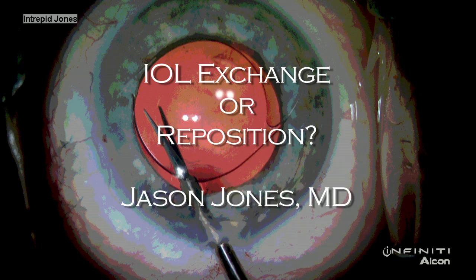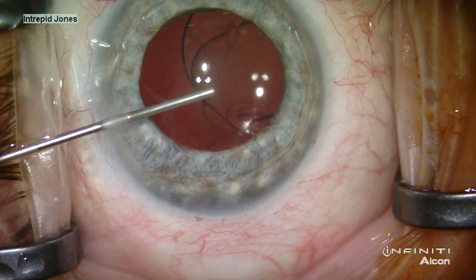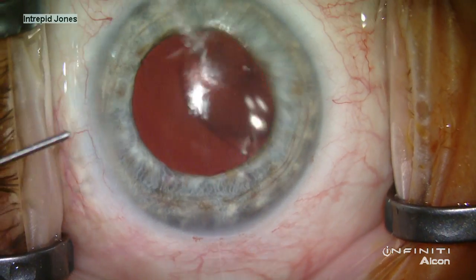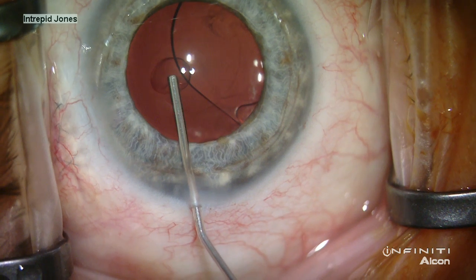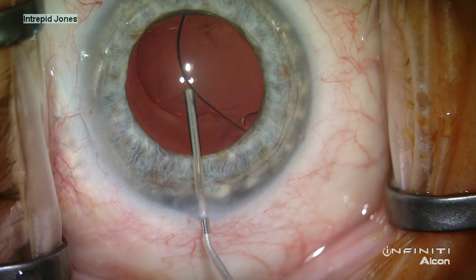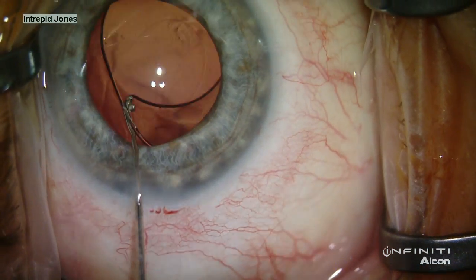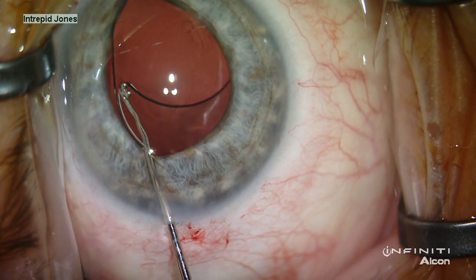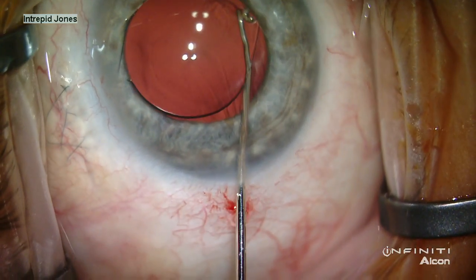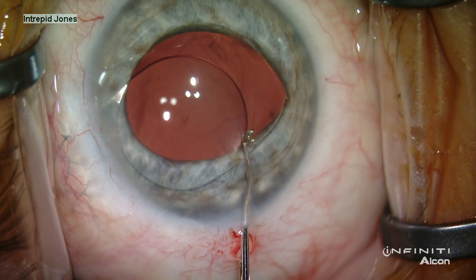When I first encountered this patient with a de-centered PMMA lens in the sulcus, my first intuition was that the lens had to be removed and replaced with possibly an iris sutured lens. After viscoelastic placement, I rotated the lens out of the sulcus into the anterior chamber in a fairly easy maneuver, and in fact I found that the lens was completely normal in all respects.